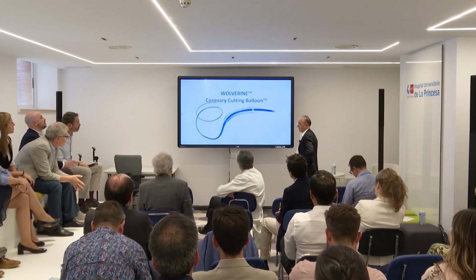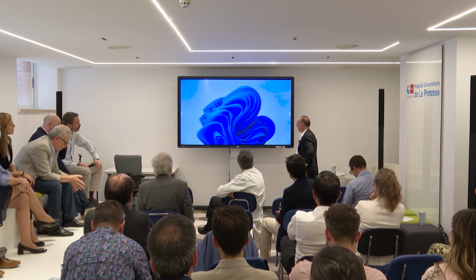The penultimate. So moderate calcification, I think, yes, there is a role for this, also because the new generation, as you said, have an improved deliverability as compared to the first cutting balloon. So I think that there is an important role. But if you have high calcification, I don't think so. Yes, I basically agree with you. If I have the lithotripsy and the rotablator in very highly calcified, I think I would use those or the rotational therapy.